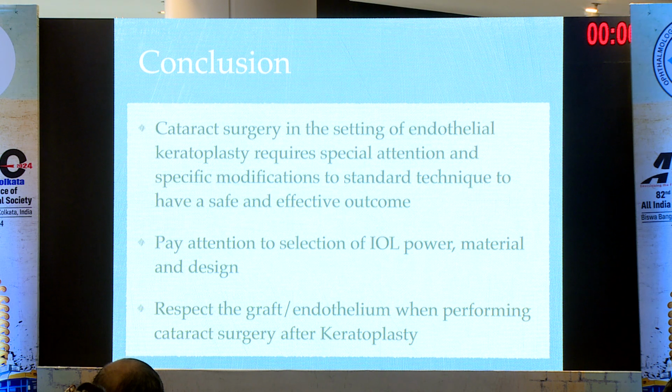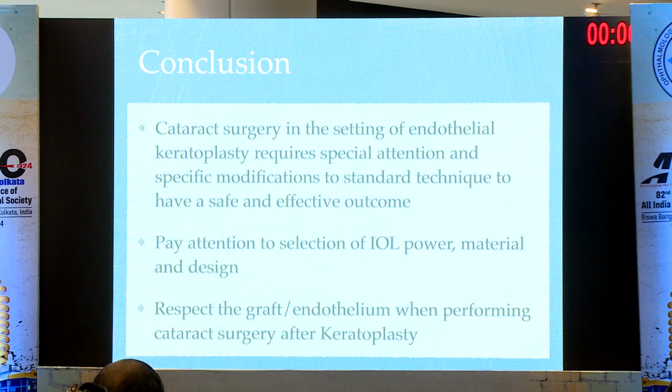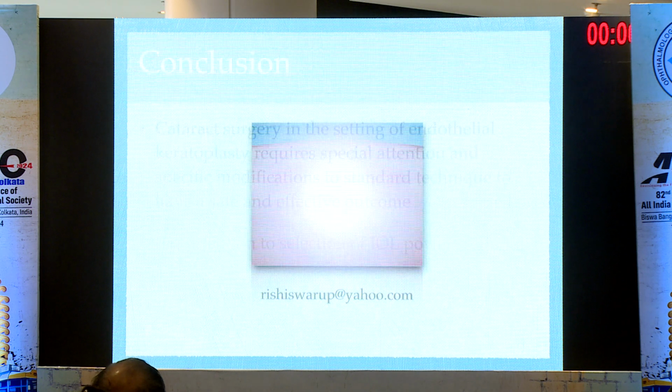So cataract surgery in the setting of endothelial keratoplasty requires special attention and specific modifications to standard technique to have a safe and effective outcome. Pay attention to selection of lens power, material and design. Respect the graft and endothelium while performing cataract surgery after any keratoplasty. Thank you.